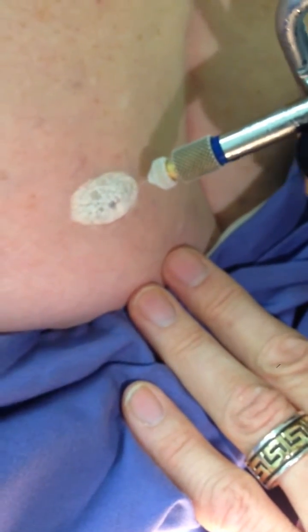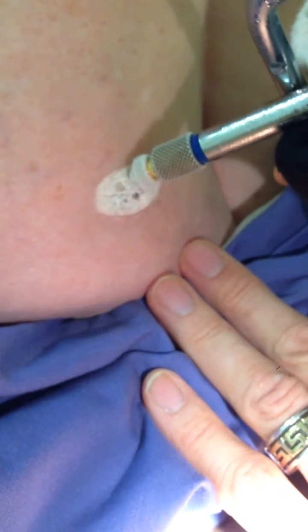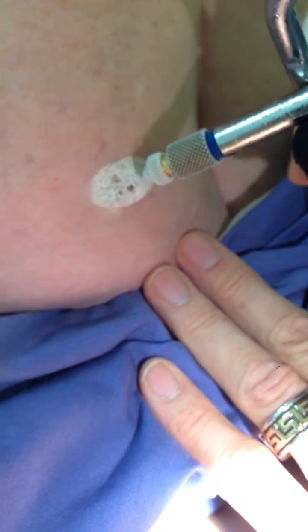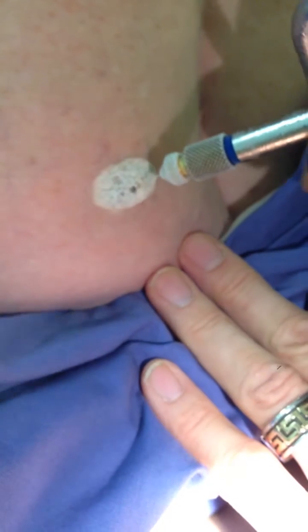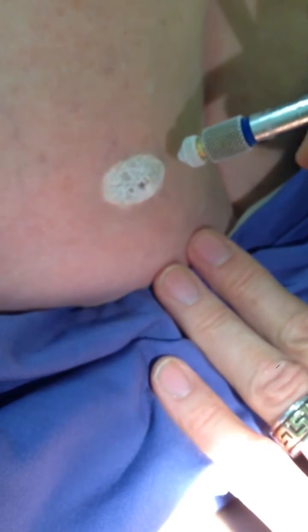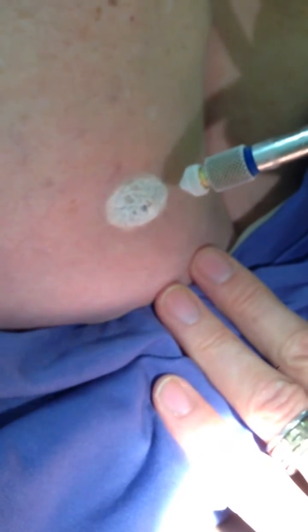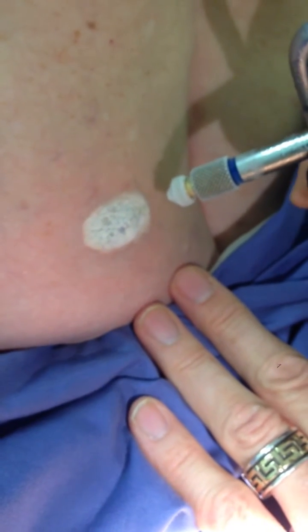When you continually freeze something, it spreads the freeze out laterally, but when you pulsate the freeze like this, you get depth of freeze, and it's depth of freeze in these SK lesions which is needed. So that's what we're doing, but this is not a quick process. You have to stick with it and keep on pulsating that freeze.